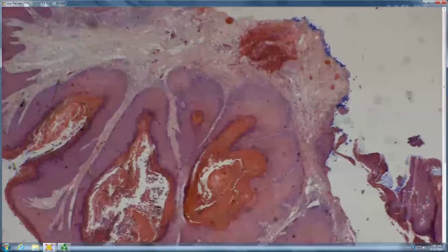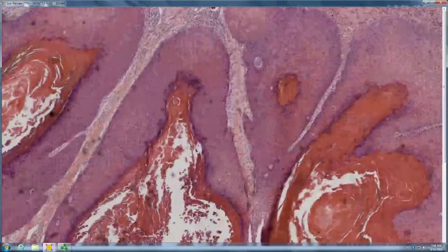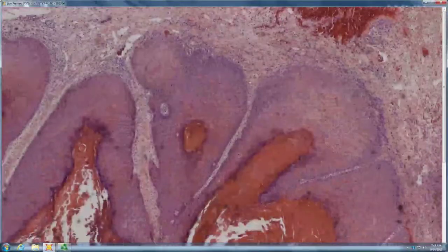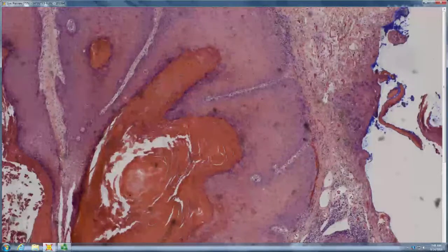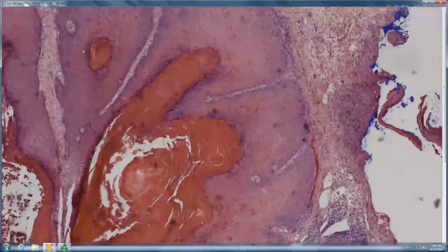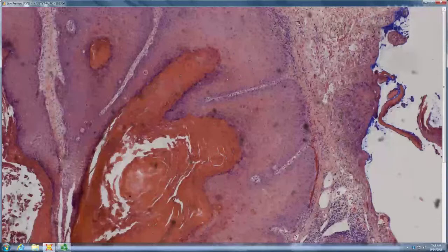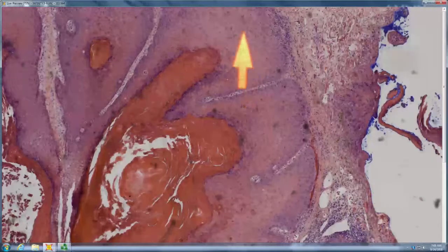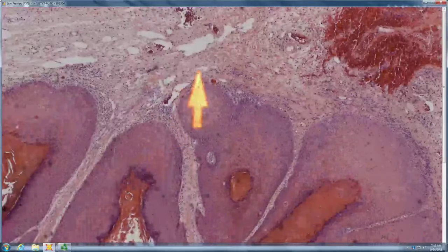So, the keratin in there. Papillomatous. It's not particularly warty. Not exophytic warty, but there certainly is hypergranulosis and some round parakeratosis in it. Kind of a glassy red epithelium. Looks like it's starting to bud downward.